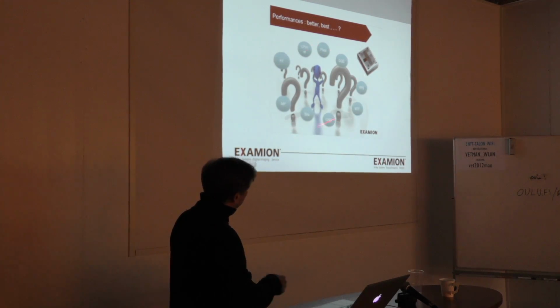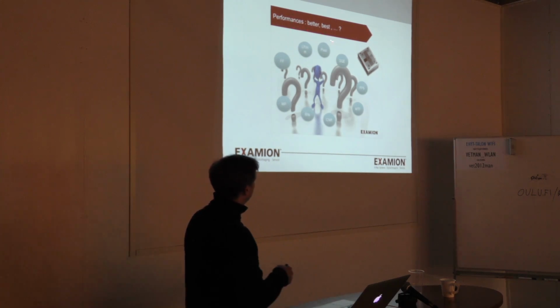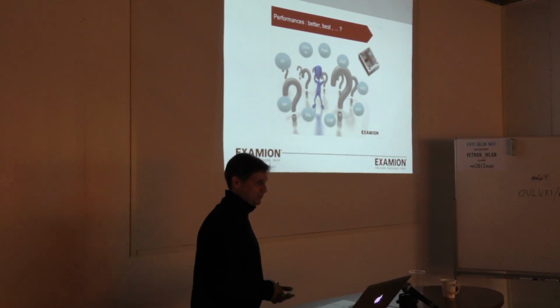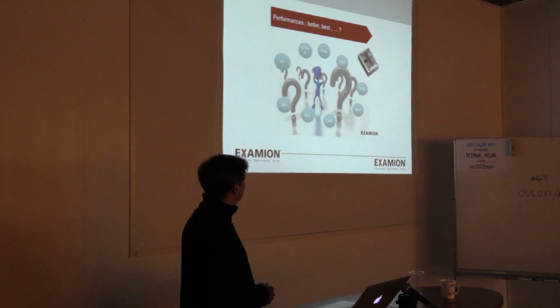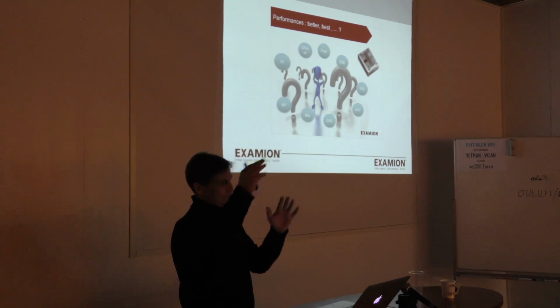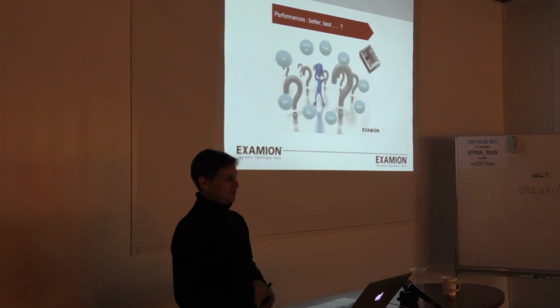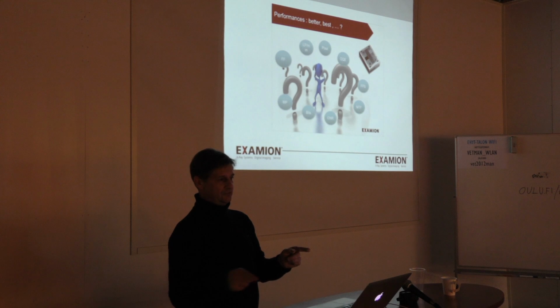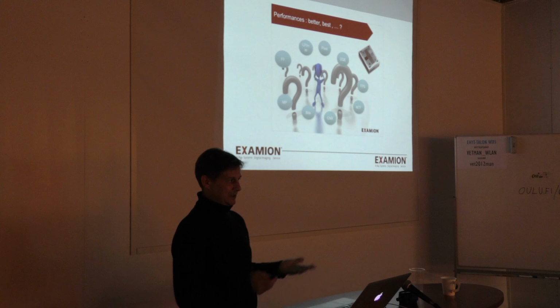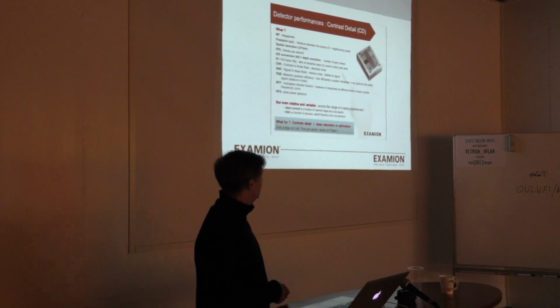So instead, all these parameters, to be honest, they all hang together. If you're looking for a panel, even if you say how much is the line pairs per millimeter, well, it could be fantastic. You could have mammographic quality, but it doesn't mean anything if, for example, the FF, which is the fill factor, how many of the pixels are available within that big size of a panel, is low. One pixel might be very small, mammographic quality, but if there are big dead spaces between those pixels, then the fill factor will be maybe only 50% or 60%. So again, you will have a low quality, just comparing those two parameters. Difficult to know exactly what you're getting into.